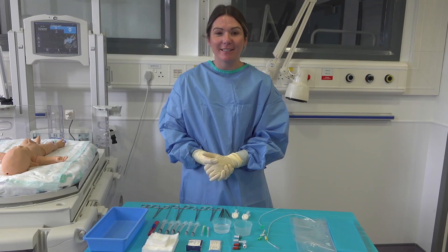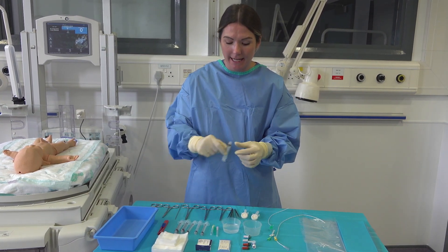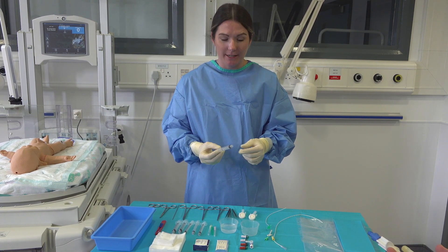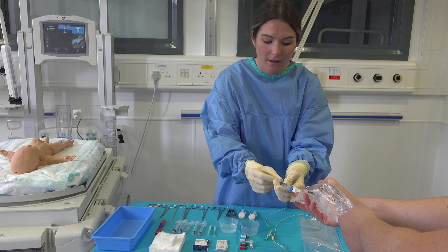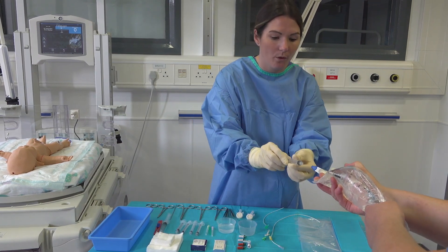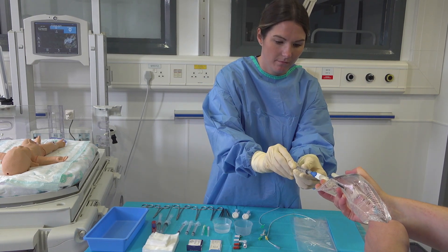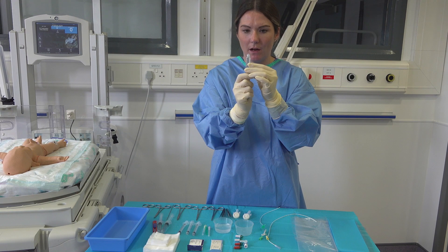We're now going to discuss how to prepare your lines for insertion and flushing of the lines. I am going to take my 5ml syringe and draw up some normal saline for flushing of the lines. The bag of normal saline has already been cleaned and allowed to dry for 30 seconds. Just be careful when doing this that you don't touch any parts that aren't sterile. For flushing of all the lines I'm going to draw up three syringes, making sure that all air bubbles are out of the syringes.